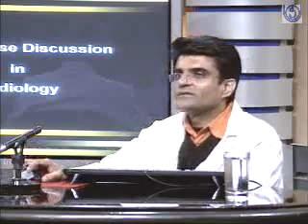Thank you very much, Dr. Razi. Sir, should we proceed? Can I have the X-ray film on the monitor, please?